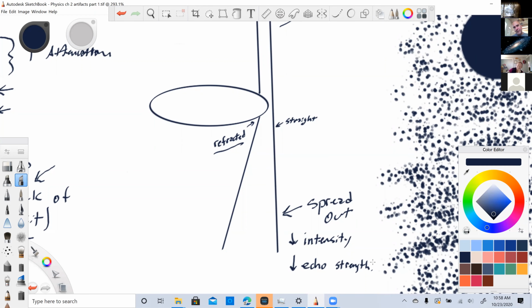So this creates a special form of shadowing that's not really related to the attenuation of regular shadowing. Regular shadowing is more attenuation than expected. The resulting beam beyond the attenuator is weak, and you either get little or no information. This has nothing to do with attenuation. It has everything to do with decreased intensity of the beam. And so our echoes are going to be weaker than expected, as in what the time gain compensation expected of it.